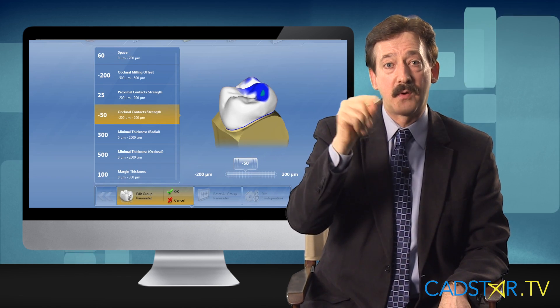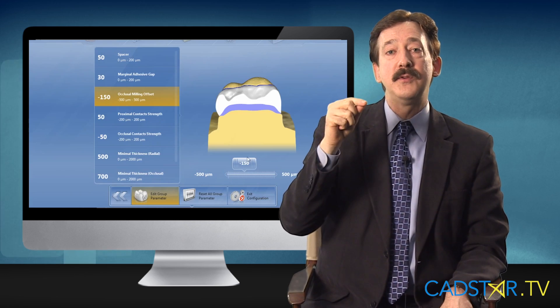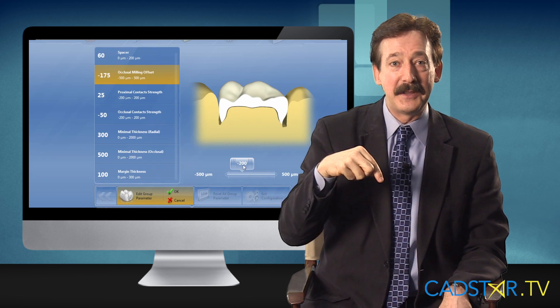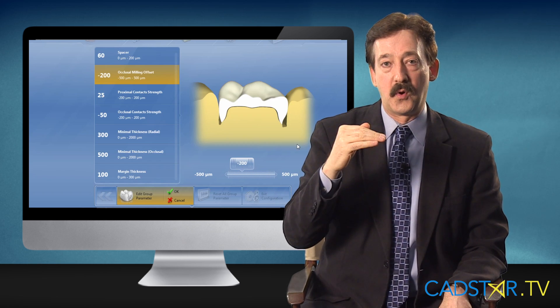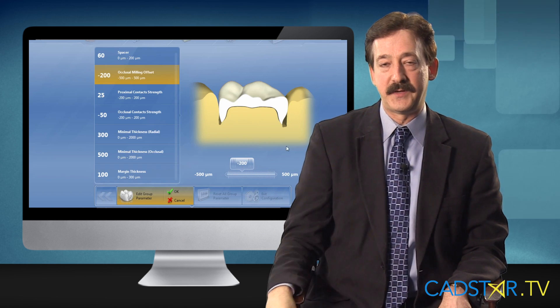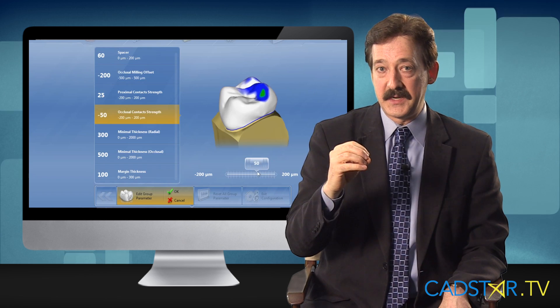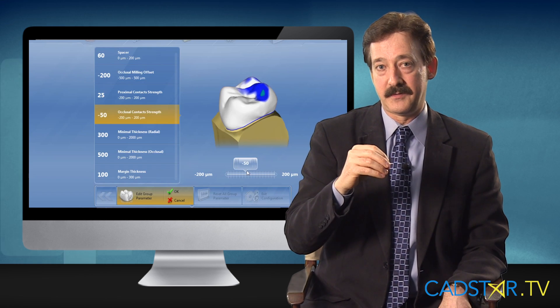Now, one shift for Omnicam users — at least at this time, I use negative 200 for occlusal offset and negative 50 for occlusal contact strength.